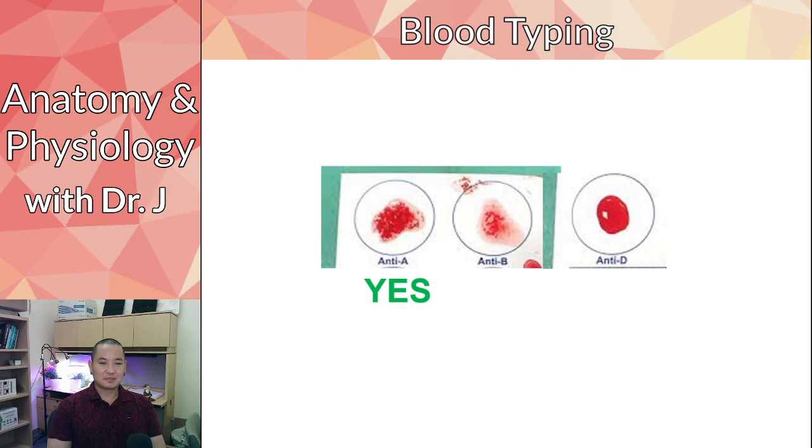Don't worry about this image, I'll find better quality images for the exam, but this is just an example. It's kind of hard to see, but notice that you have light areas and then you have these dark red patches as well, so it's not quite uniformly colored, so you do have agglutination there. How about anti-D? This is actually a shine here in this blood droplet. So do we see agglutination there? No, we don't see agglutination.